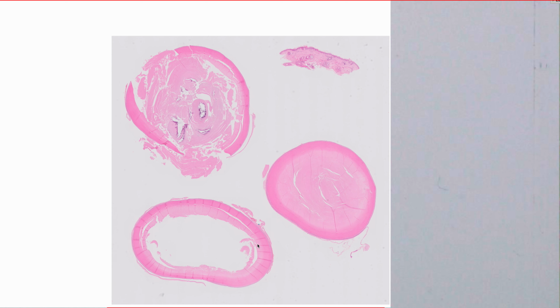So I've got here an example of a pilar cyst of skin, which is one of the very common types of skin specimens that we receive. One of two common types of epidermal cysts, the other being the epidermoid cyst. And here on the low power appearance, we've got a little piece of skin here that was taken off the surface, and then these three pieces here, which represent the pilar cyst.